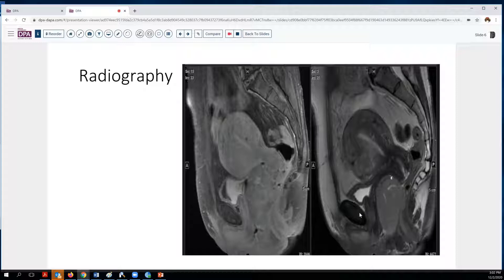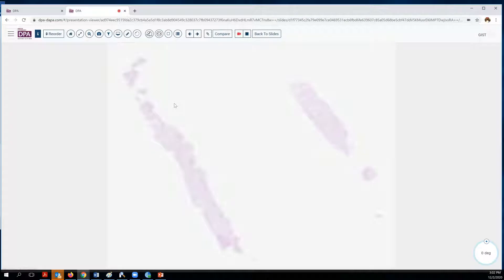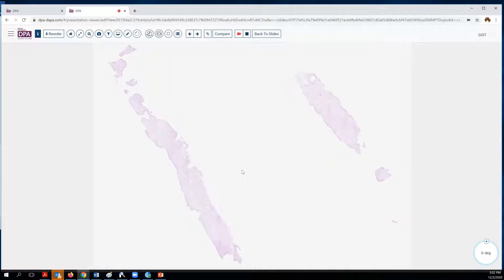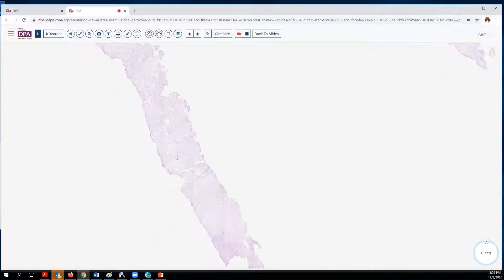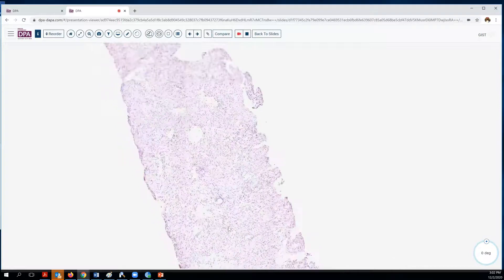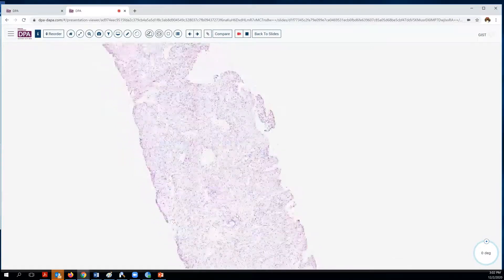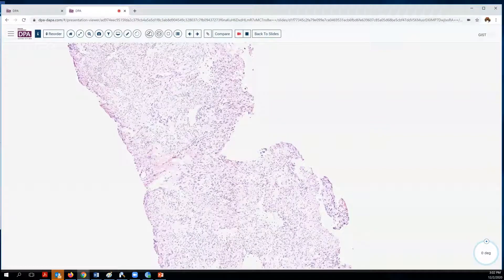Here we see it on the T2-weighted image. In this patient, evaluation that seemed prudent included an exam under anesthesia, which produced a biopsy that then came to our attention for frozen section evaluation to ensure that they had adequate sample. Here is a representative section from our frozen section.